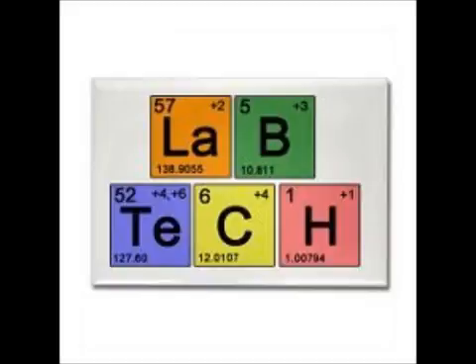And the reason people have gone to the analyzer is it takes away the areas of technique that sometimes affect the bleeding times. So everybody can do the bleeding time a little bit different.